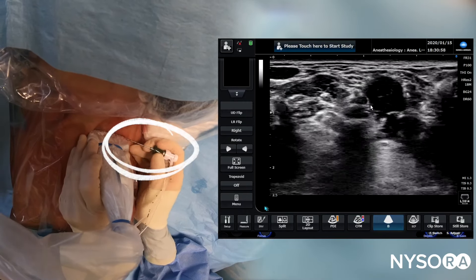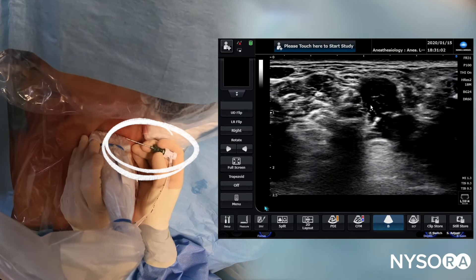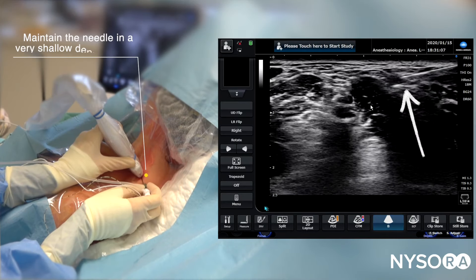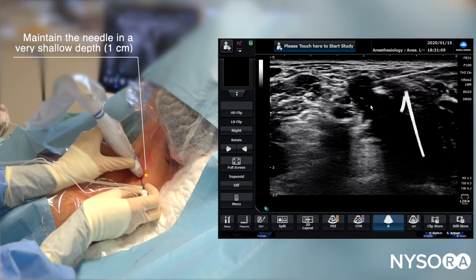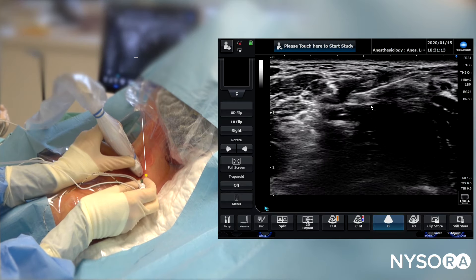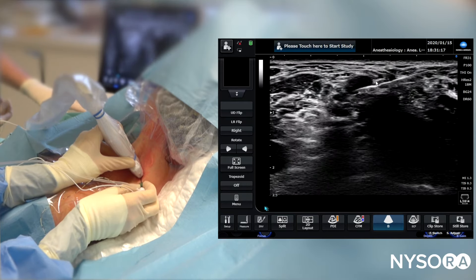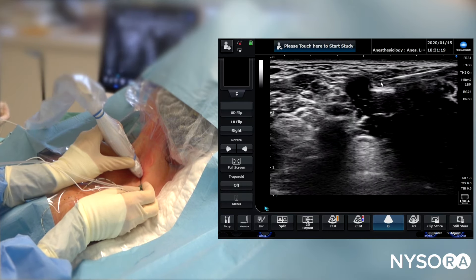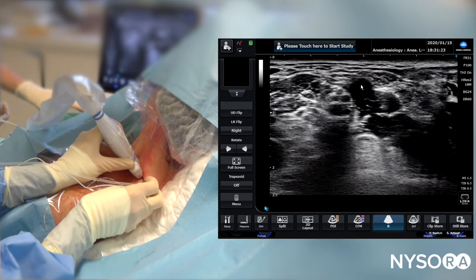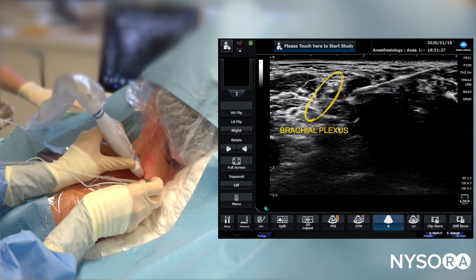Now we insert the needle, which is pre-loaded with the catheter, making advancement of the catheter simpler. The needle has been advanced through the subcutaneous tissue and now enters the middle scalene muscle. You can see the perceptible loss of resistance as the needle passes underneath the fascia of the middle scalene muscle. We're now looking at the needle tip, which is very close to the brachial plexus space.